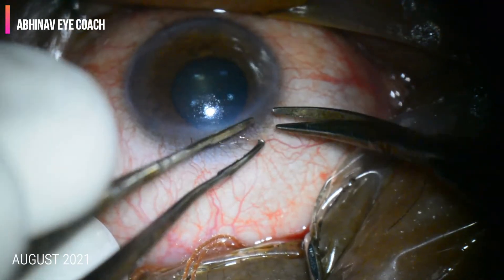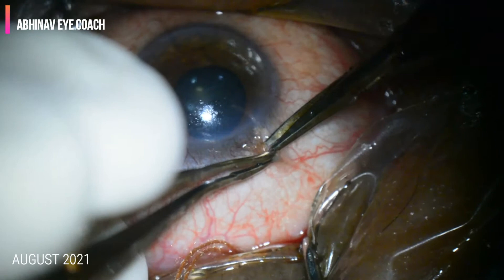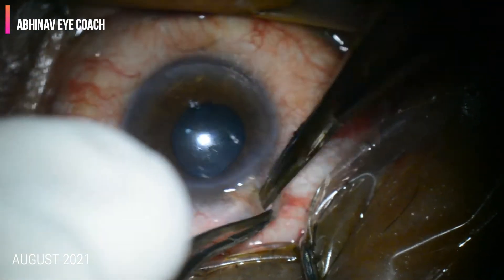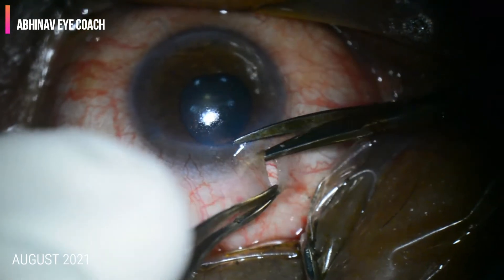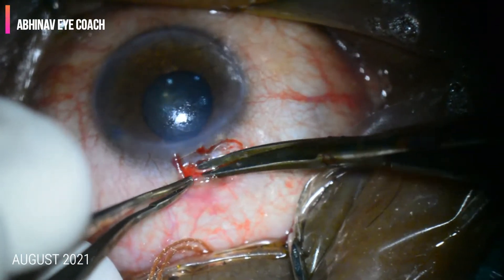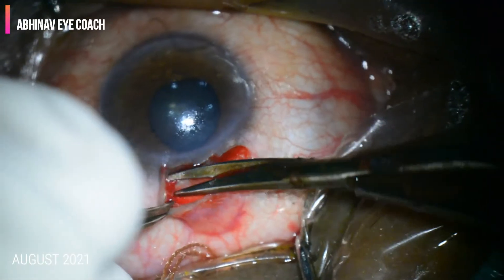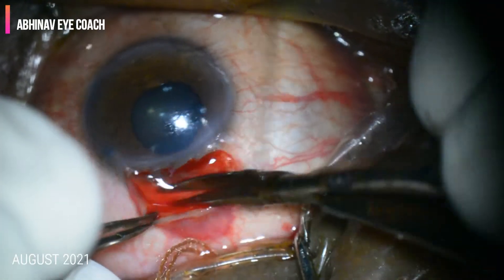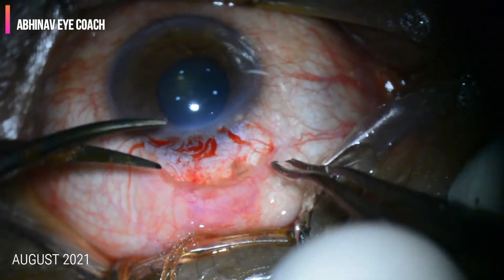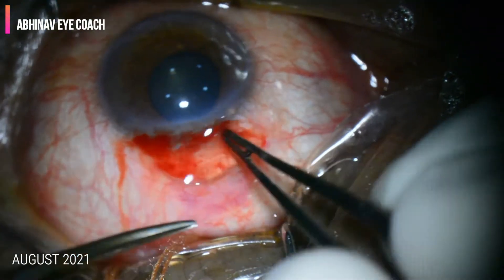To start with, a peritomy is performed with the help of Westcott scissors. The conjunctiva along with Tenon's capsule is separated from the sclera. The conjunctiva is incised at the limbus. Care must be taken not to puncture or perforate the conjunctiva or the underlying sclera.